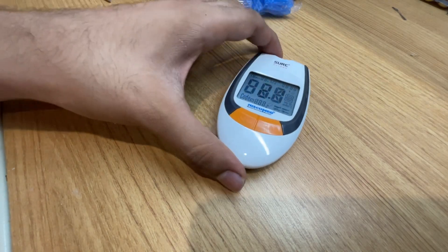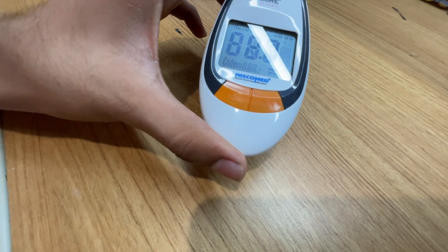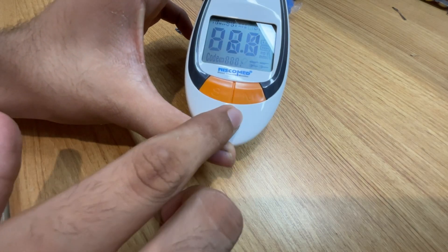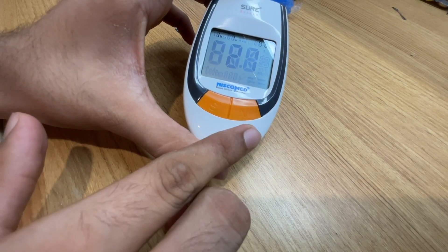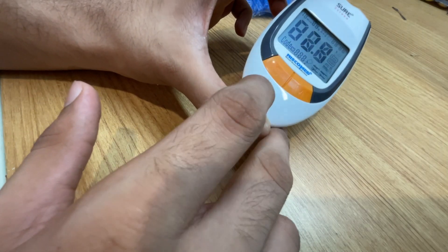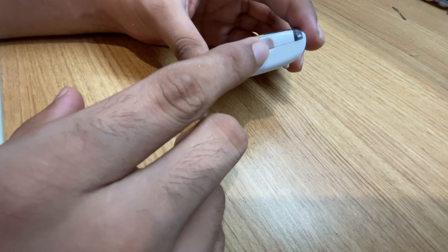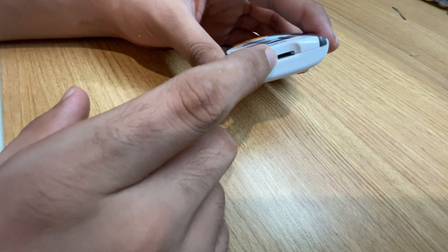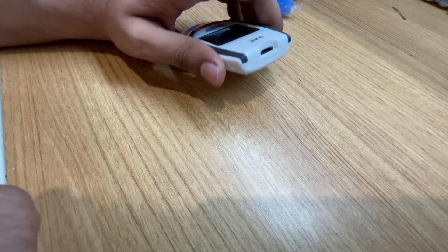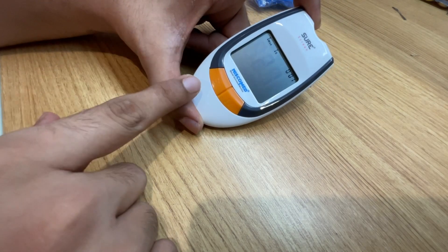The device has two buttons. The M button is for memory mode — to view your previous recordings. The S button is for setting mode — clicking it takes you into the settings menu. There is also a strip slot where you insert the test strip, and an ejection button to eject the strip. You can also set the time and date on this device, which is pretty cool.